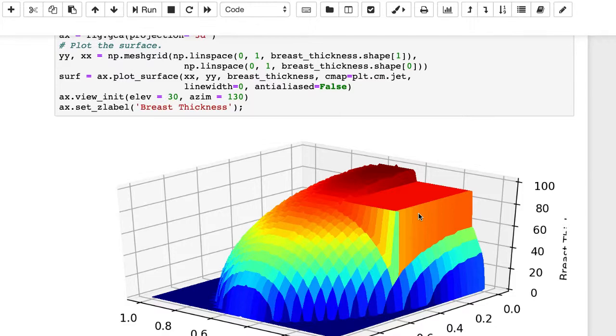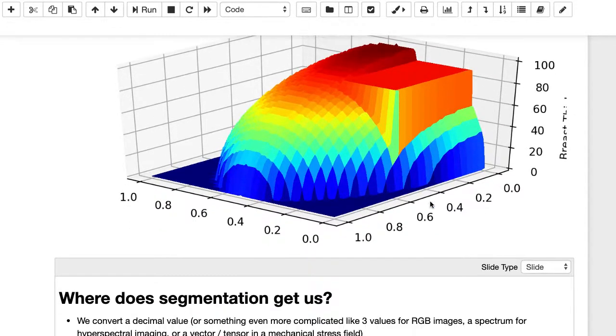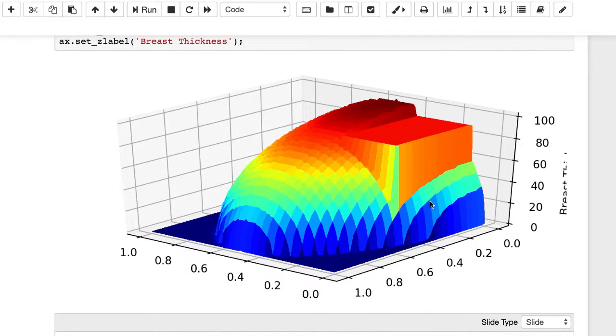And so that's where these models become quite difficult, because those structures we now don't see. We just have this sort of compressed information where we have attenuation and thickness on top of each other. And so we can either reconstruct thickness accurately or reconstruct attenuation accurately, but we can't reconstruct both accurately at the same time. And that's one of the major challenges we deal with in 2D imaging.